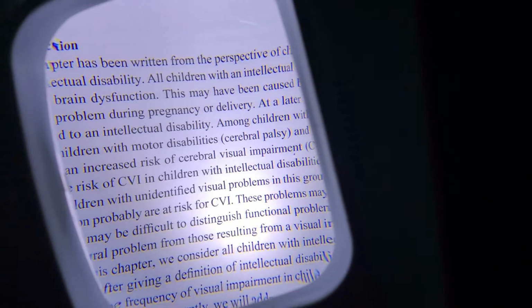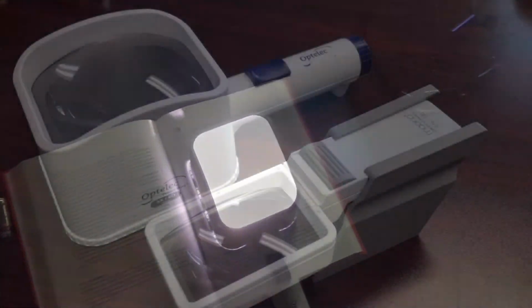And just to illustrate, we put new batteries into the Powermag, and it definitely became significantly brighter after installing the new batteries. So I've had 3 people all confirm that the Powermag is much brighter with new batteries. The Magno had no change. It was as equally bright as always.